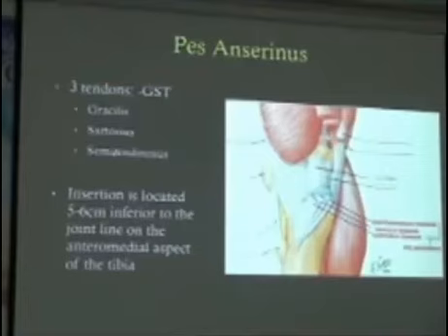And it's quite common to get a bursitis just down in this distal aspect of the tendons.